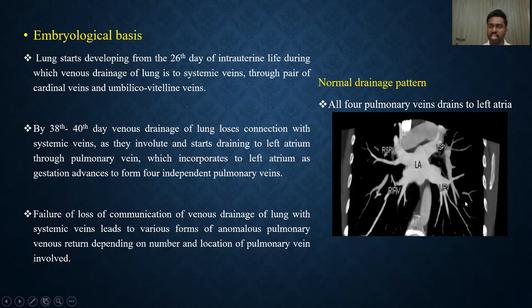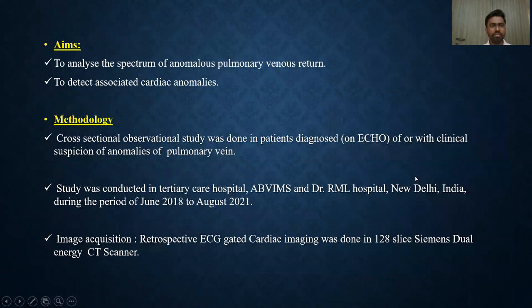This is the coronal reformatted CT image showing the normal pulmonary venous drainage pattern, in which the four independent pulmonary veins are draining into the left atrium. The aim of our study was to analyze the anomalous pulmonary venous return spectrum and to detect the associated cardiac anomalies.